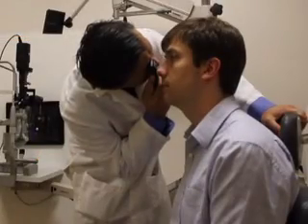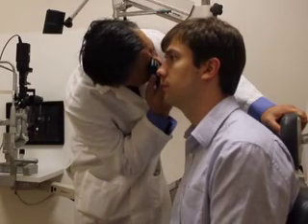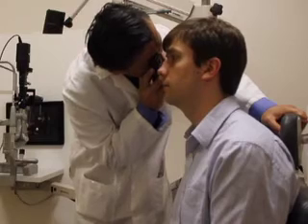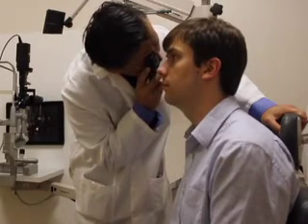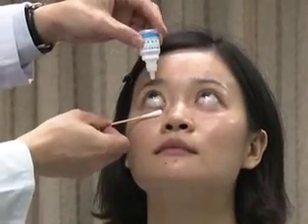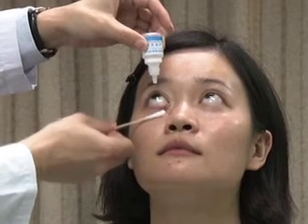In direct ophthalmoscopy, the non-dilated pupil provides the clinician with a limited view of the retina. It is best used for screening rather than diagnostic purposes. If there is clinical suspicion of ocular disease, refer the patient to an ophthalmologist for a dilated fundus examination.